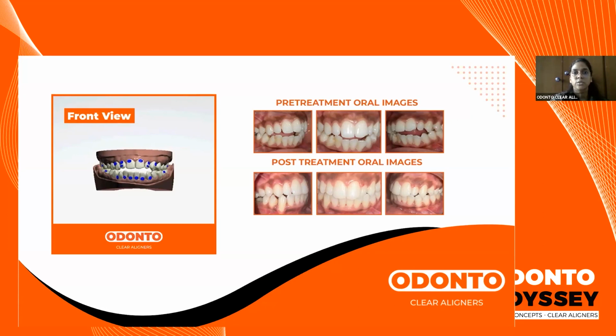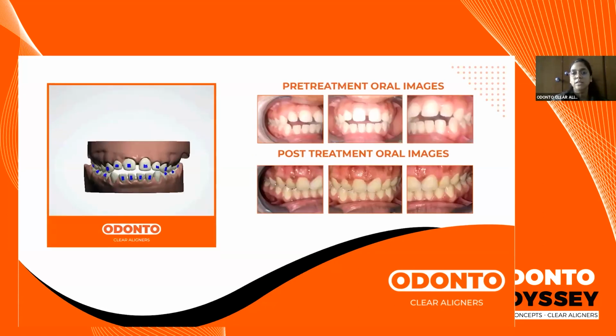I will show you. Okay, here we have another open bite case, but this is slightly different as compared to the previous one. We do not have any crowding whatsoever in this case. We have a lot of anterior spacing. We have a good diastema in the upper arch, and the posterior bite is again pretty stable.